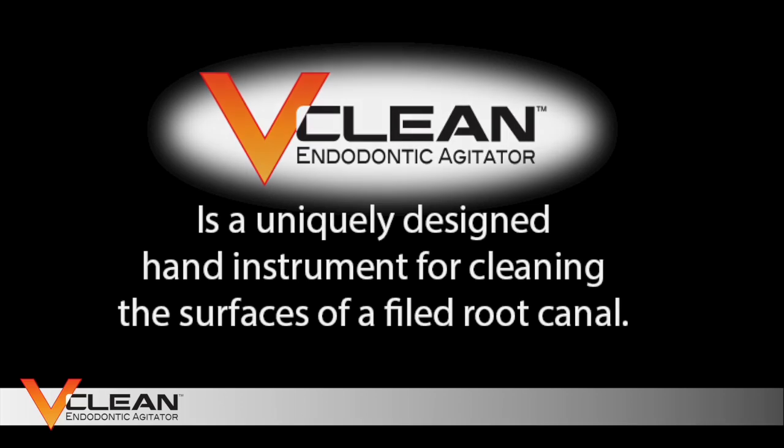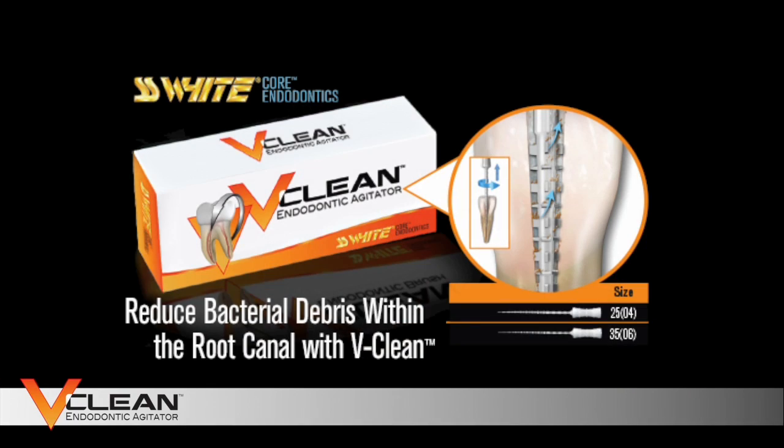I reached out to SS White, who are well known worldwide for their burrs. They suggested an injection molded application to get to the size that we need to get down at the periapical spaces. Seven, eight prototypes later, we're proud to announce that we've launched what we call the V-Clean endodontic agitator.